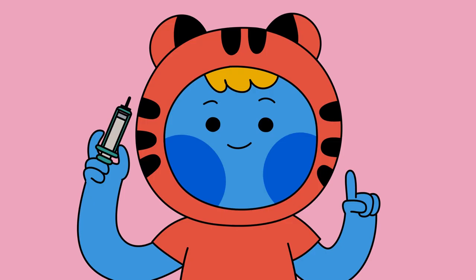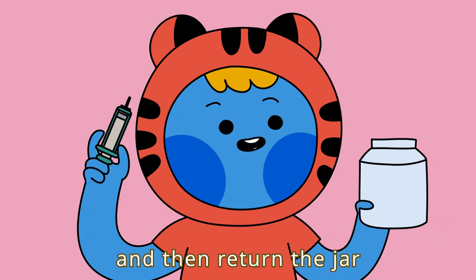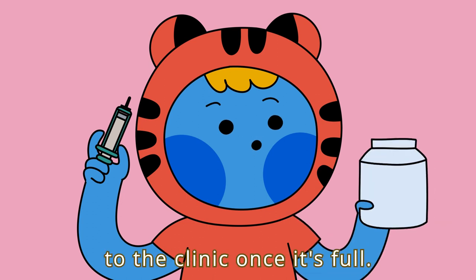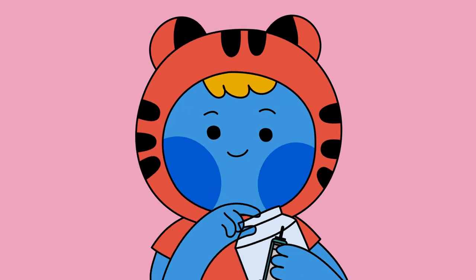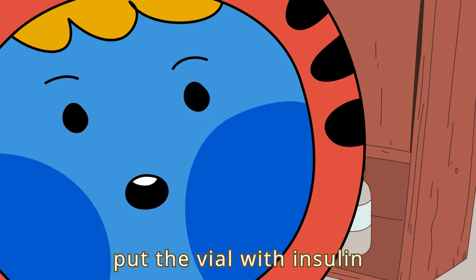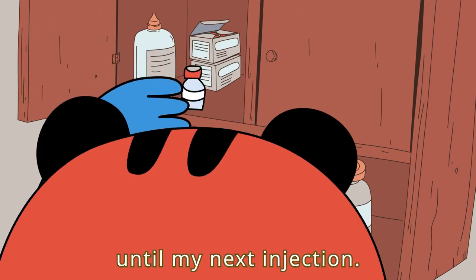Step 5: Clean up. After the injection, I put the syringe into a jar, and then return the jar to the clinic once it's full. Thanks for treating me carefully, Betty. Thanks for your help, Cody. Now I just need to put the vial with insulin back in a cool and clean place until my next injection.